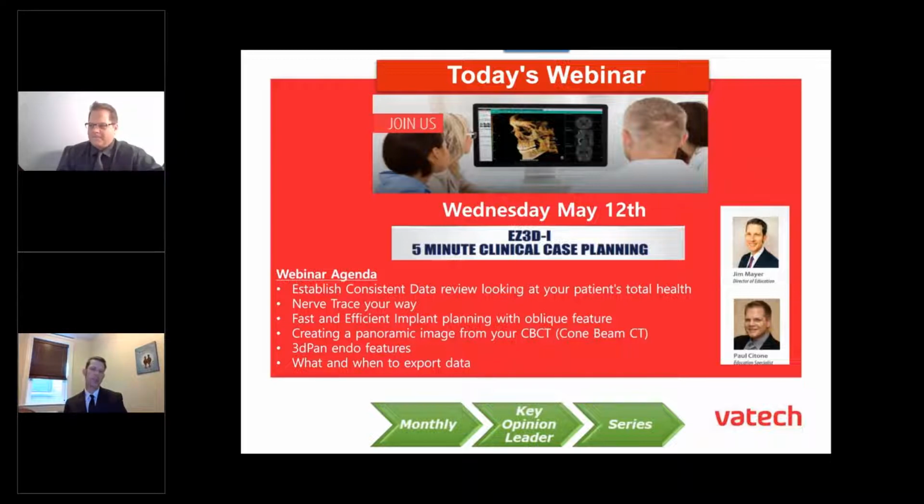Yeah, and I think mastering all of these topics leads to that 5-minute clinical case planning. There's no reason we shouldn't be able to sit down and look at a CBCT like we look at a pan, with the goal of the patient's total dental health. So I think a lot of cool stuff planned for this evening.